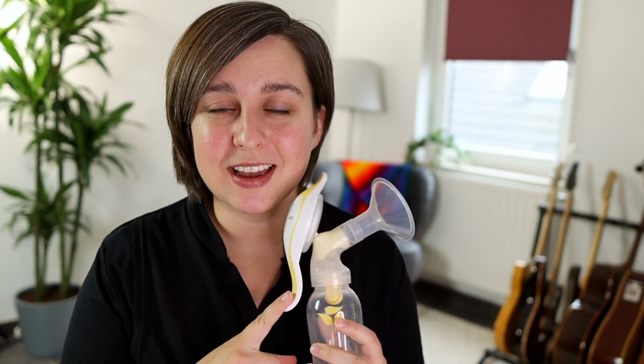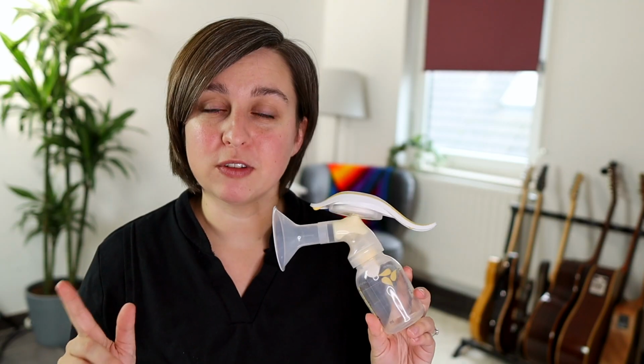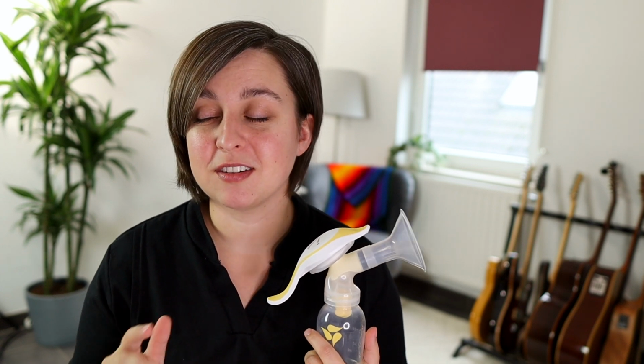So I highly recommend having a manual pump like this and just leaving it in your car or leaving it at work as a backup. This would not be fun to pump all day long with, one side at a time. I'm not going to lie. But it's better than nothing, and you don't know.